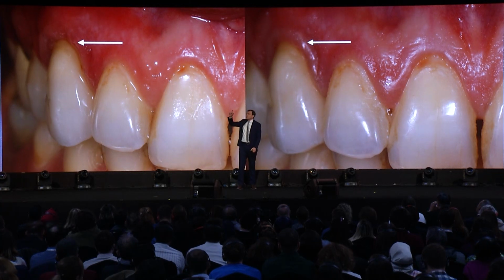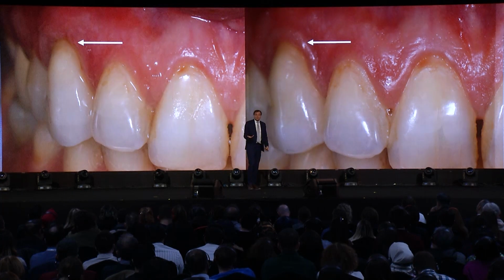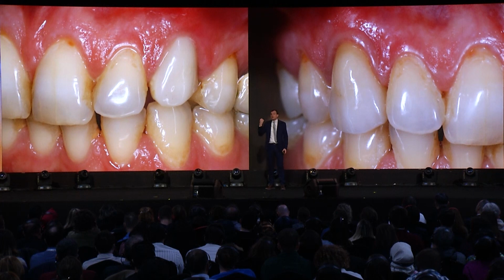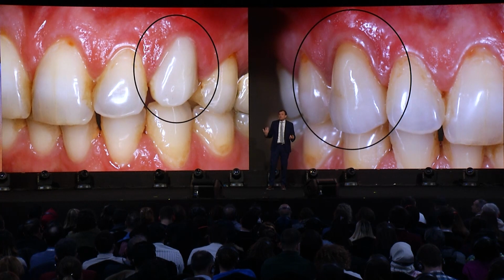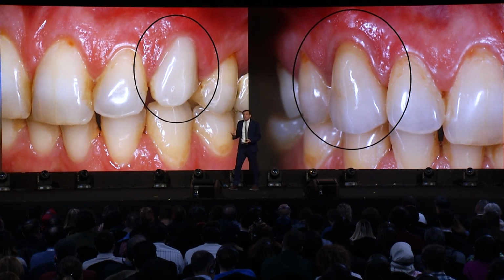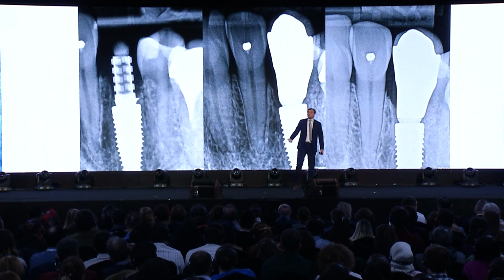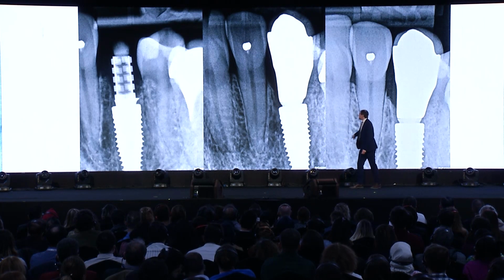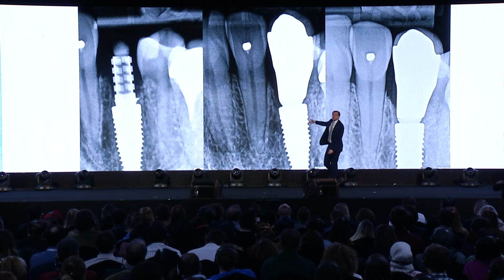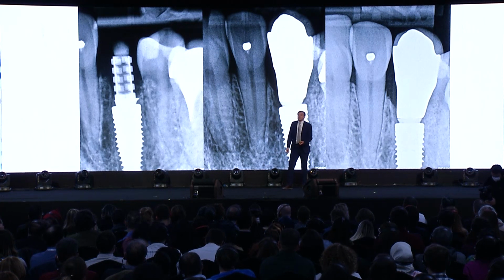You see, it looks like it was grafted, but not, because I have developed a good seal with epithelium, and then tissues start to grow by themselves. I do not really have a perfect explanation, step by step, of what's happening, but we see that with the smooth surface, even implant placement like this, which is really deep compared to the interproximal spaces, is not causing any problems.